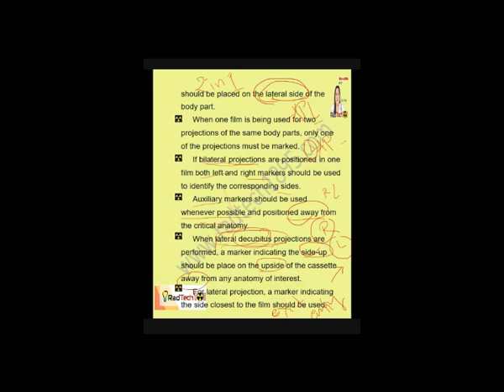So, kung naka-left, halimbawa, let me erase para mas malinaw. So, kung halimbawa, naka-left lateral decube yung patient, so yung left portion ng patient nasa table.